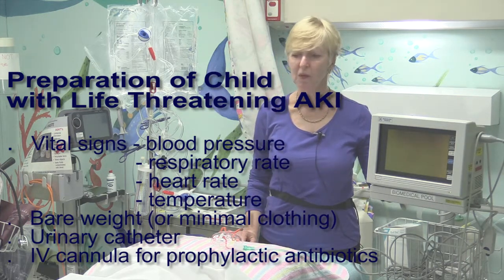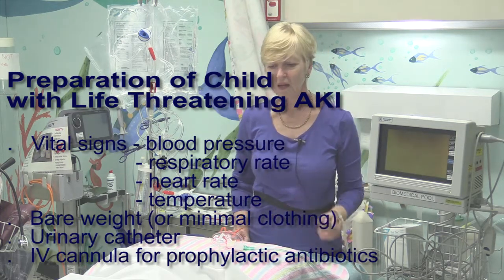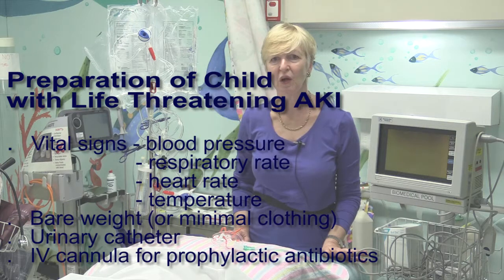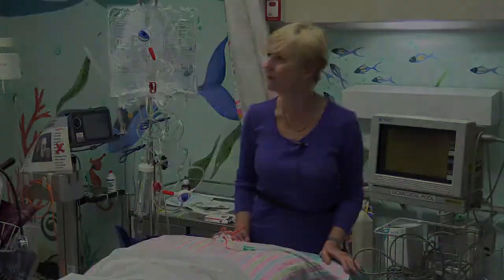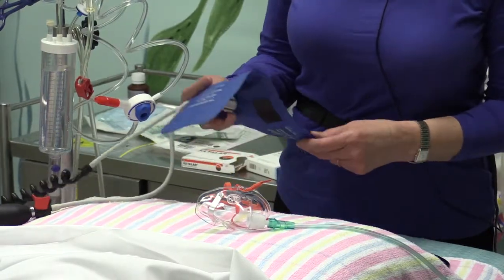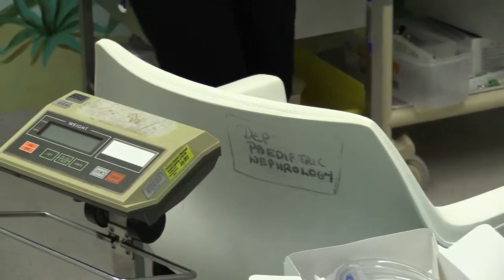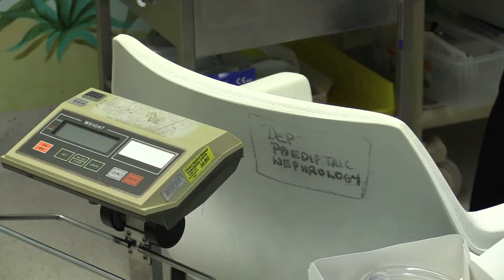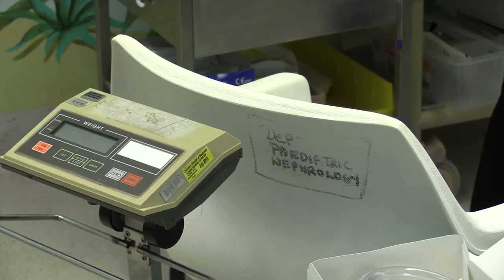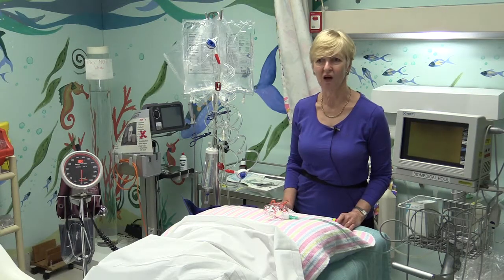If these are not available, certainly someone at the head of the bed to assess the colour and the breathing pattern of the child while you're inserting the catheter under sedation is extremely important. Prior to commencing dialysis, we will first check the child's blood pressure, whatever scales you have available to make sure that the child is appropriately weighed so you have an indication of their fluid status prior to dialysis.